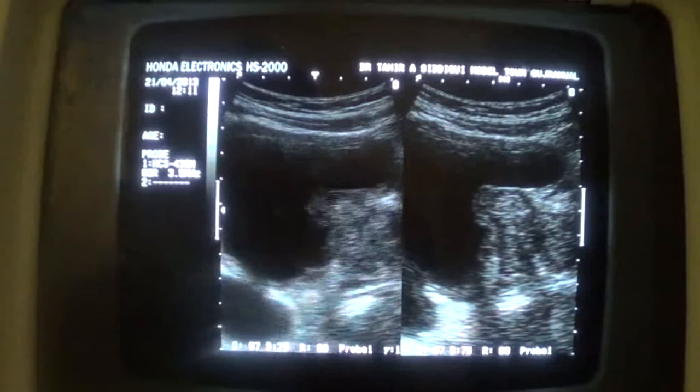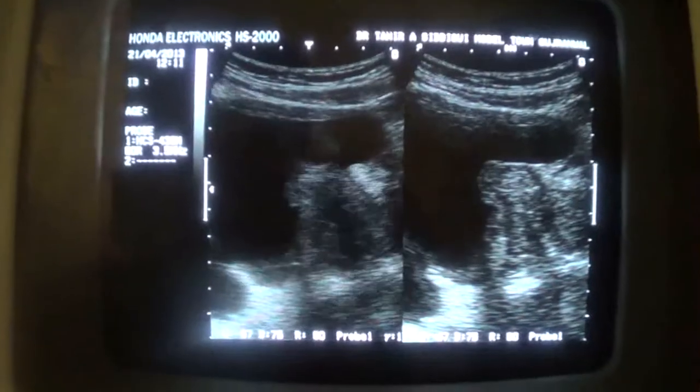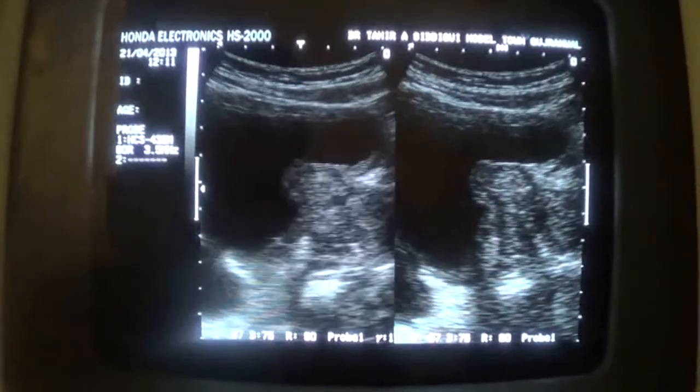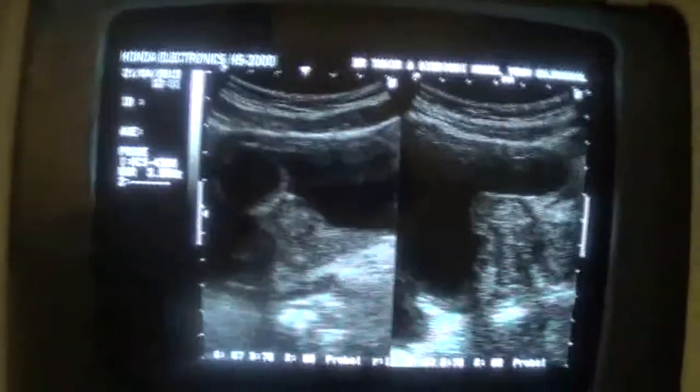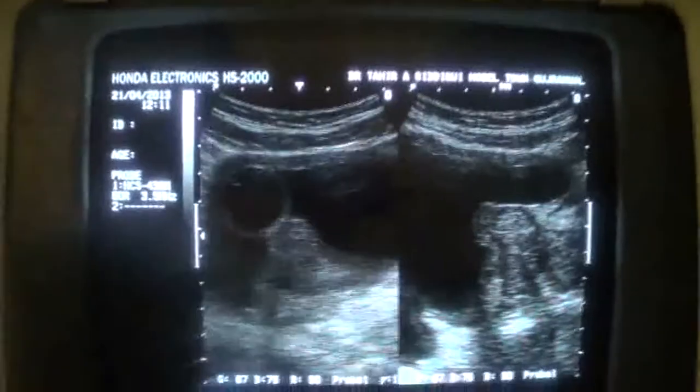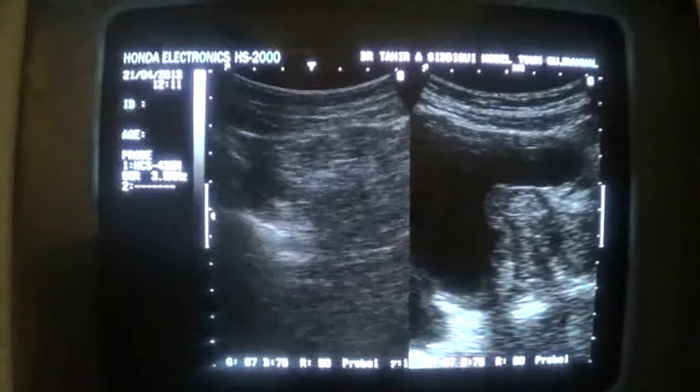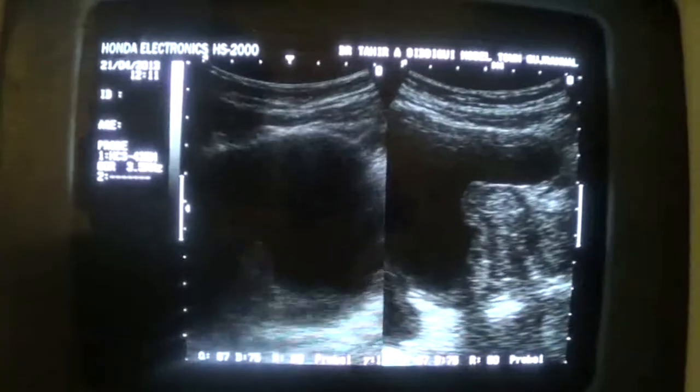This is the prostate in longitudinal section. Now, this is the same prostate but in transverse section.